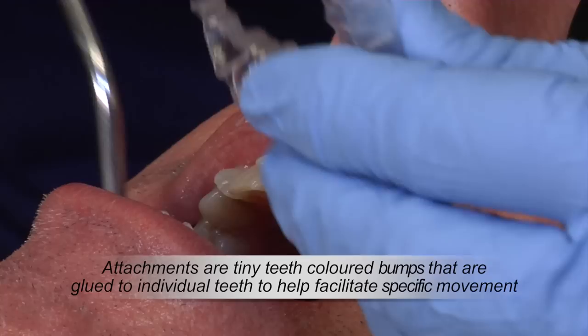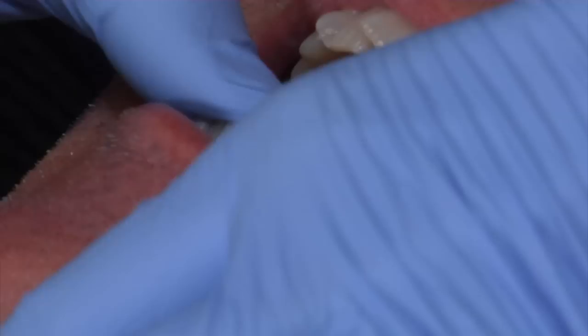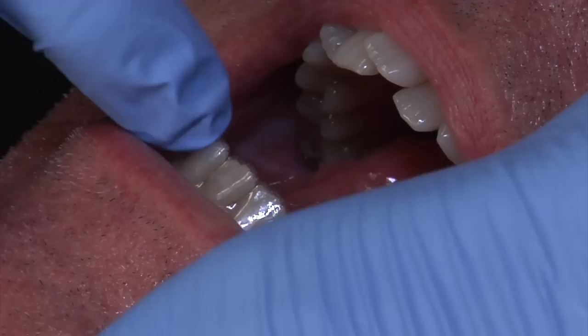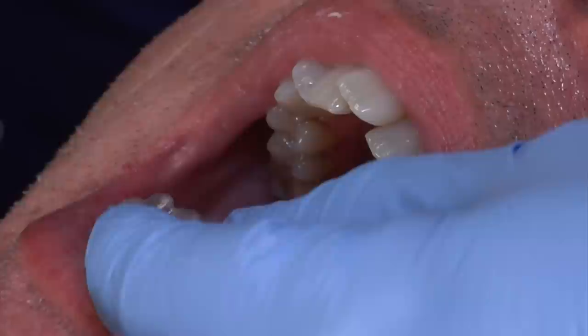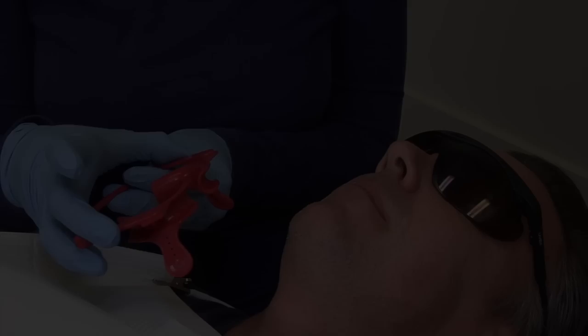Now we're ready to start bonding the tiny attachments. We'll try the bottom tray on — blow dry all the teeth, clear out any saliva, and try the tray on. We're going to press down everywhere on the biting surface of the teeth to make sure the tray fits perfectly. And it does — excellent. We'll remove the tray and get it set up with the glue for the attachment bonding.